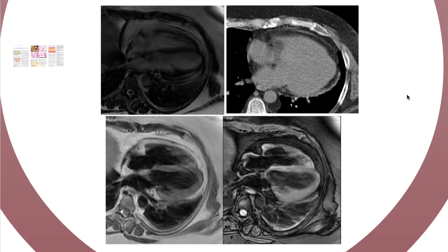And that's diagnostic. And if you look at the size of this patient, there's a lot of subcutaneous fat, mediastinal fat, and then epicardial fat. So I'm not surprised to see lipomatous hypertrophy in this patient.